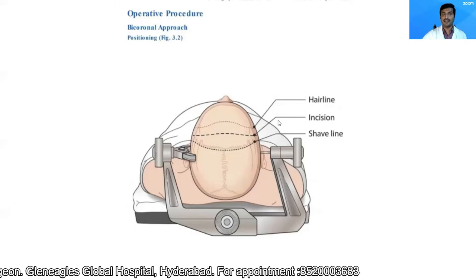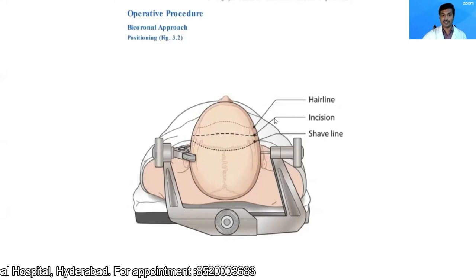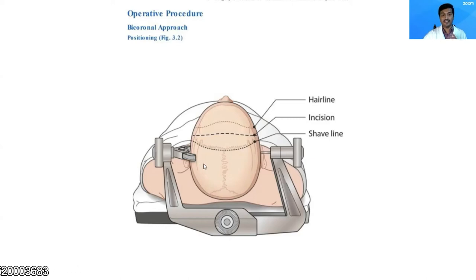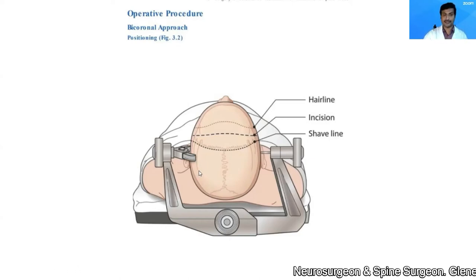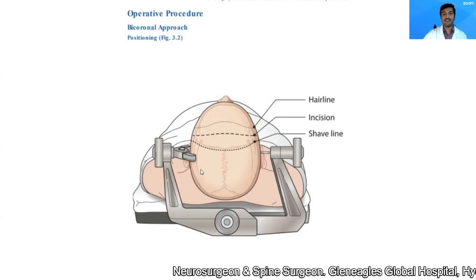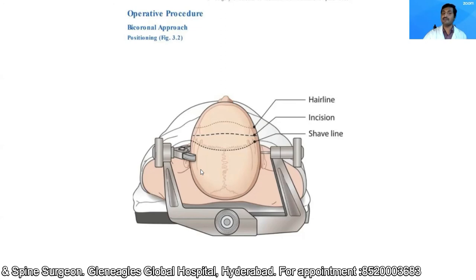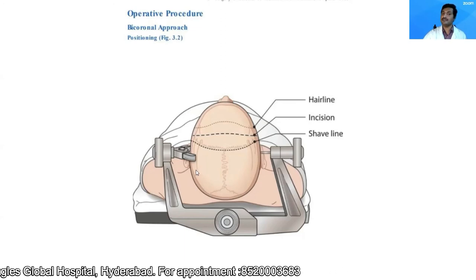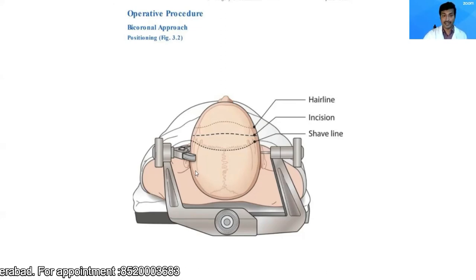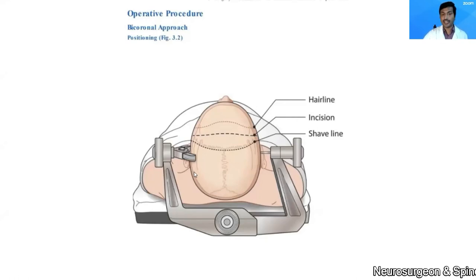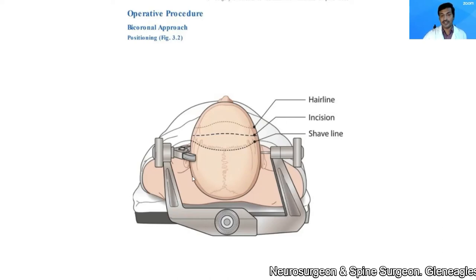Regarding the operative position, we fix the head. In my institute and personal experience, when planning for a bicoronal technique, I prefer rigid immobilization in a three-pin headrest. However, if you need to save time, you can position the patient on a horseshoe headrest.